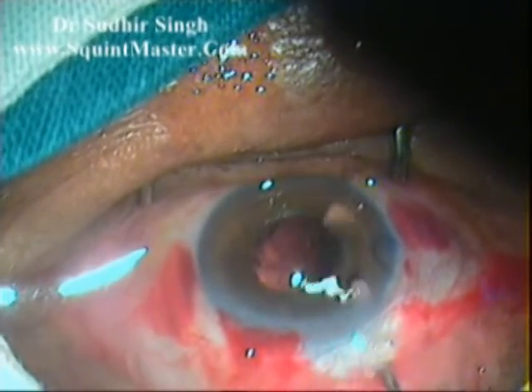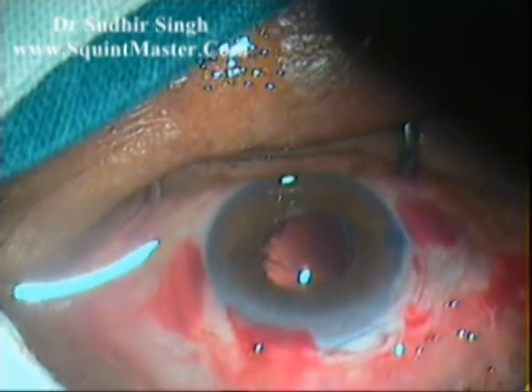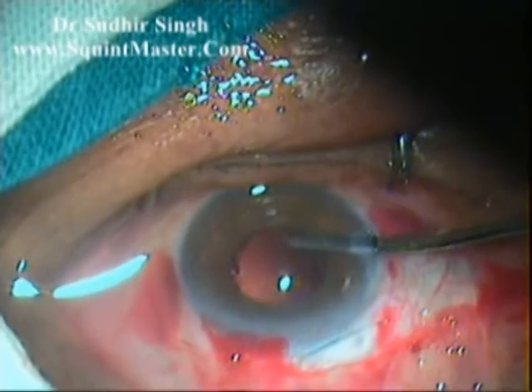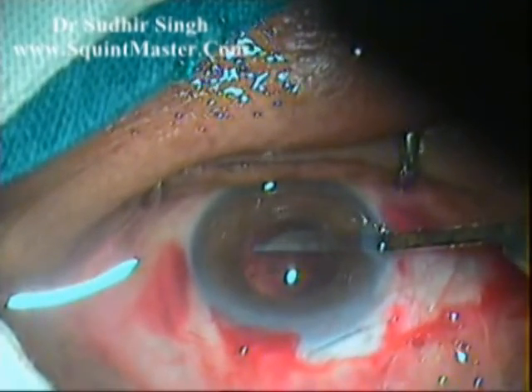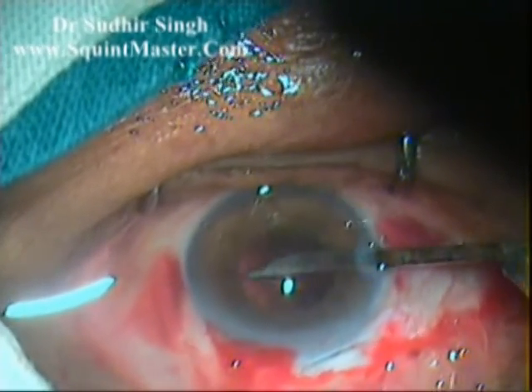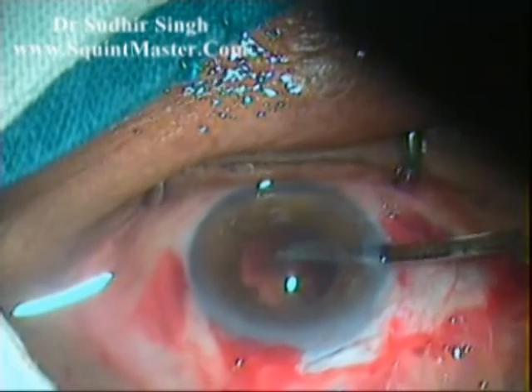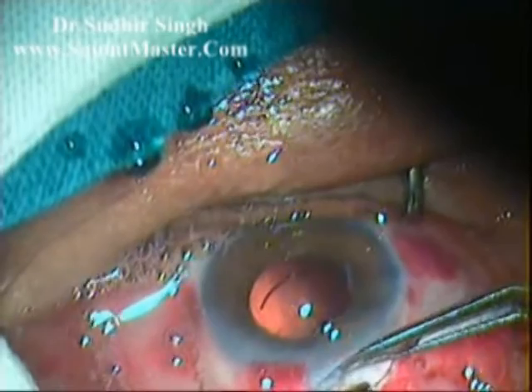Cortical matter and viscoelastics are flushed out with irrigating fluid in a 10 cc syringe mounted with a hydro cannula. The remaining cortical matter is cleaned up with a 23-gauge Simcoe irrigation cannula from the side port.